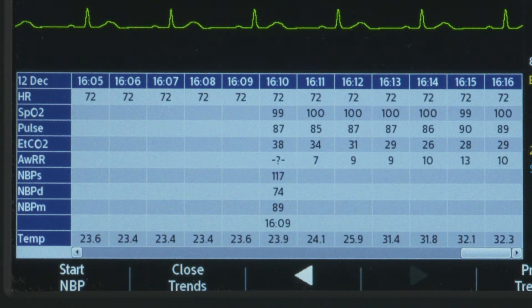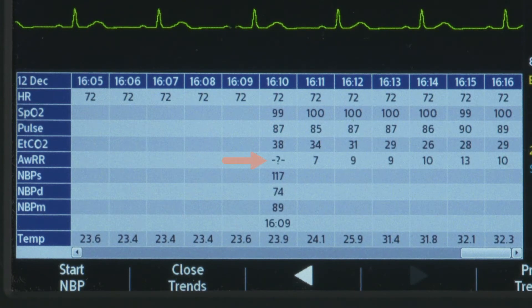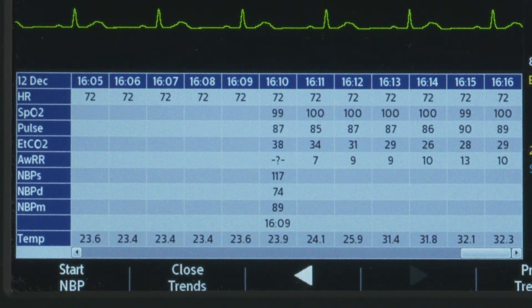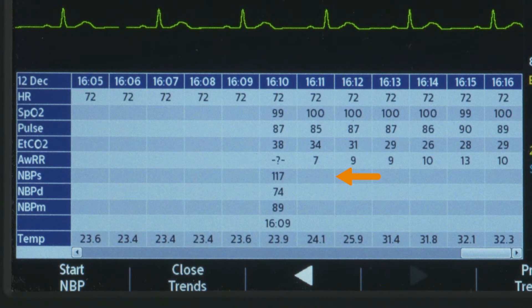The trending report only displays measured parameters. This symbol indicates invalid data, while the same symbol before a numeric indicates questionable data. A blank space indicates data is unavailable.